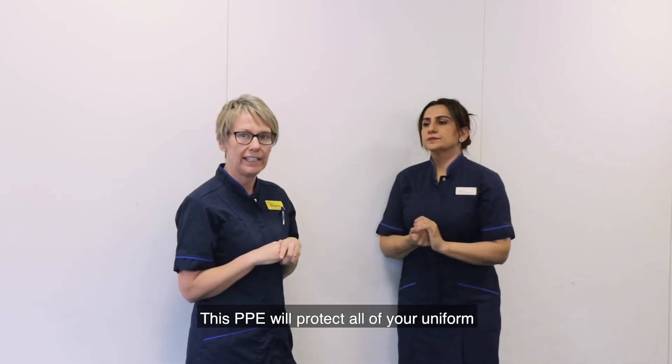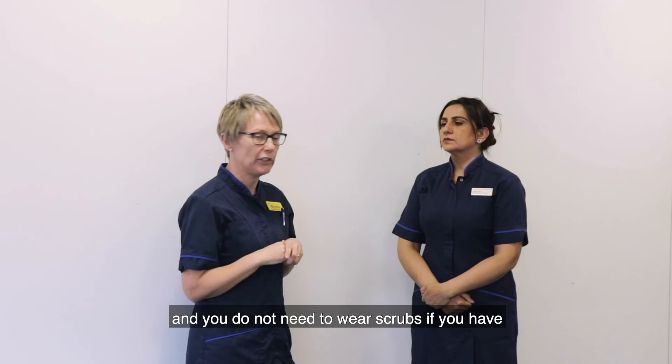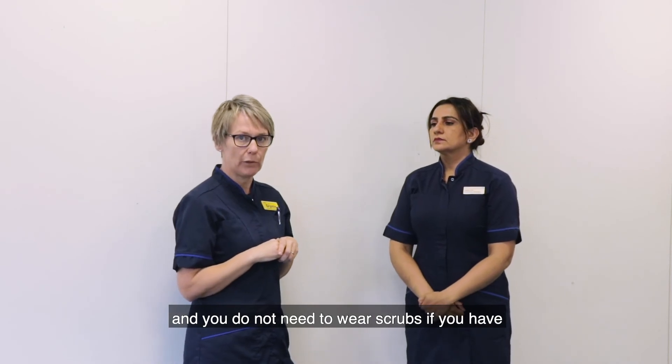This PPE will protect all of your uniform and you do not need to wear scrubs if you have your own uniform.